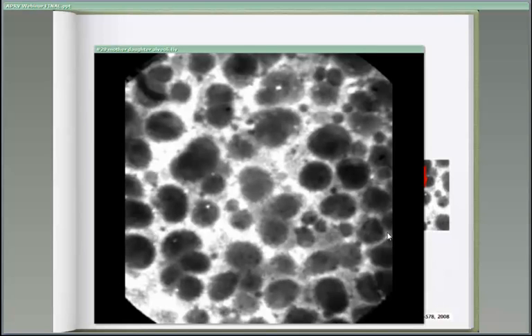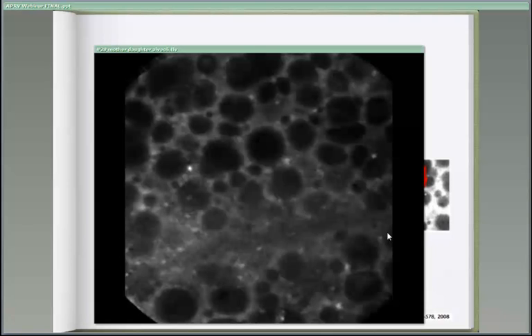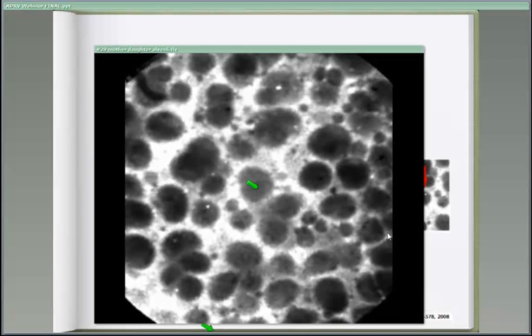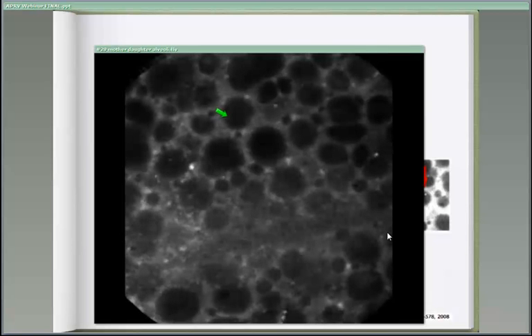Hopefully you'll see it here. Okay, so you'll see the actual dynamic recruitment here. It's a little bit better in the slow motion version, which is coming up. Now watch for the alveolar size actually shrinking, the mother alveolus actually shrinking as the inflation occurs. And again, as you share the load, you may actually decrease the strain in the tissue, which is potentially very, very important. So this raises the question of not just tidal volume, but lung volume, and how gas is distributed within the lung.